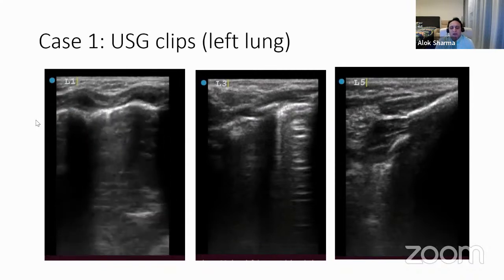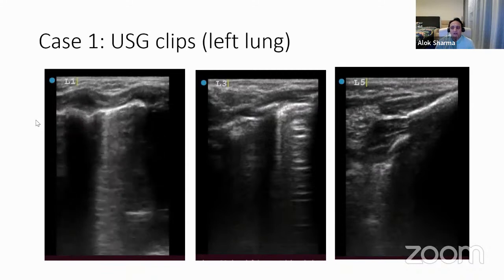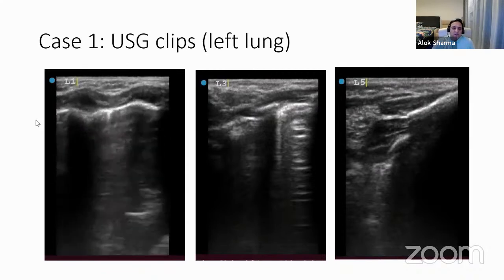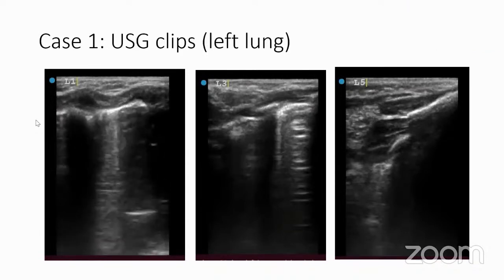The other thing that I would recommend is that your images are a little bit grainy. Every ultrasound machine has what is called a soft or sharp mode. Your focus at this stage is at the level of the pleural margin, which is why the pleura looks beautiful, because you're using a very high frequency probe, 13. This was a term baby, was it? Yes, this was a term.